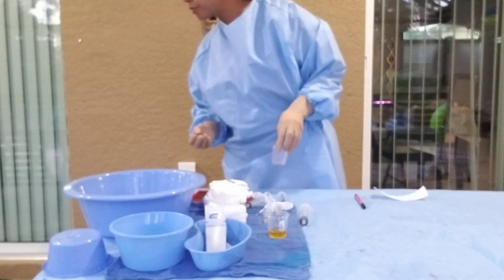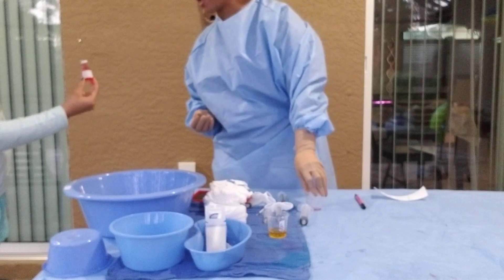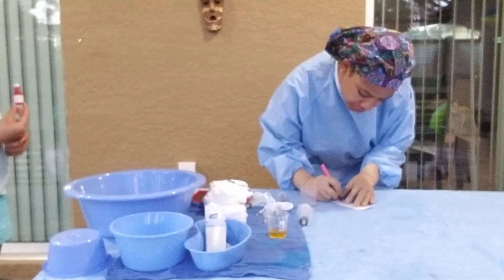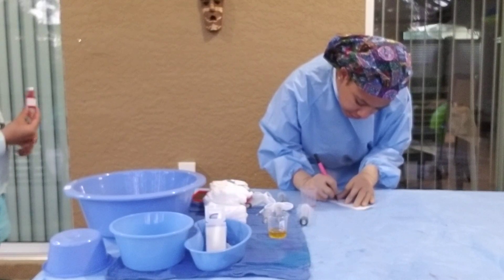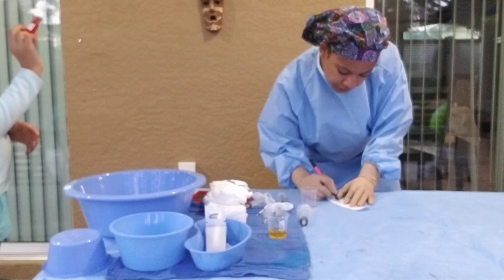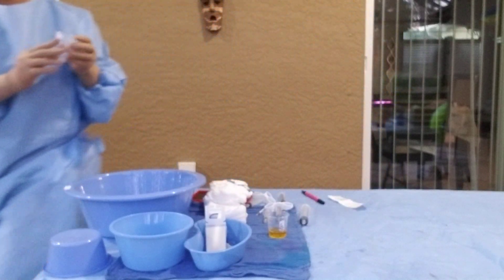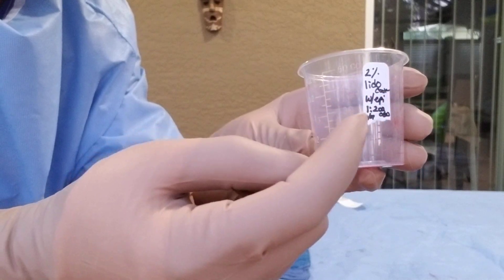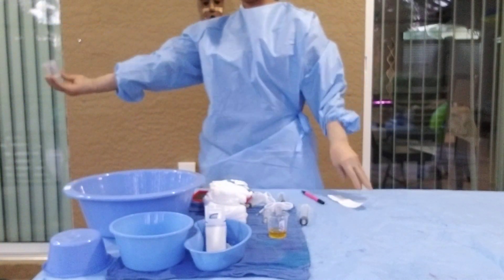This is 2% lidocaine with epinephrine, expiration date November 2027. I'm going to write my label: 2% lidocaine with epi, 1:200,000 strength of the epi, expiration date 11/27. I place that on my medicine cup. My label reads 2% lidocaine with epinephrine 1:200,000 and the expiration date. Now my circulator is going to pour for me.